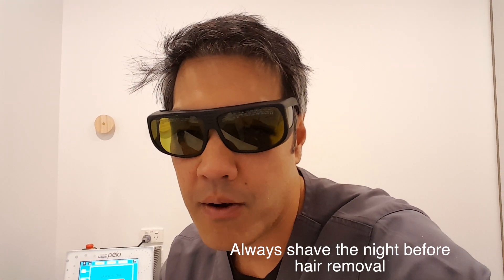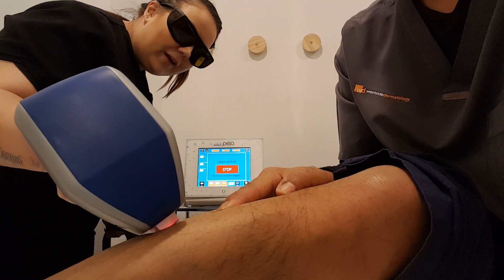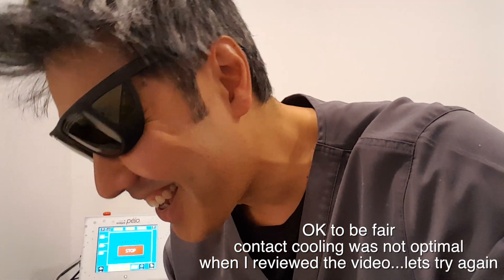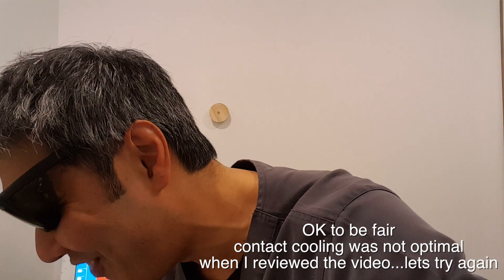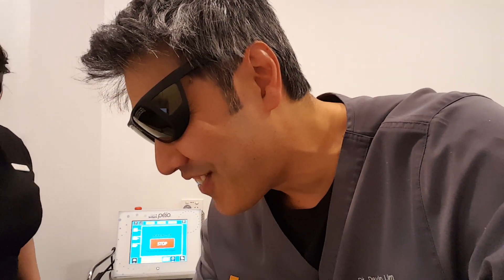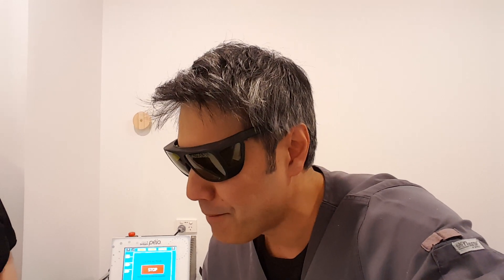I don't have any contraindications to hair removal — let's see how much this hurts. Three, two, one. Whoa! Okay, sorry, I wasn't prepared for that. On a scale from one to ten, that was about a six. Can we try again? I'm such a wuss. The Lightsheer — seriously — from a scale of one to ten, that was a zero. A 755 Alex with a good Zimmer cooling system, probably three out of ten. I'm not trying to be smart here — that's just the honest comparison.